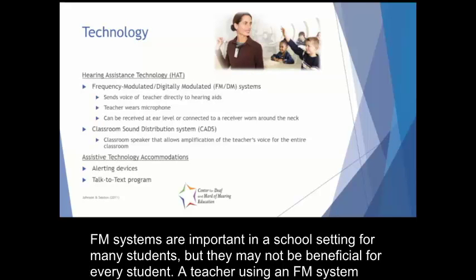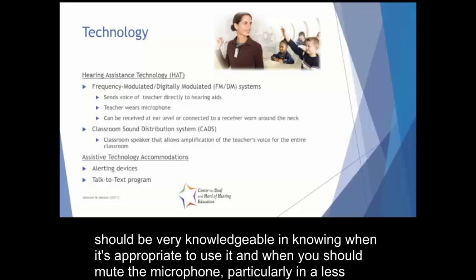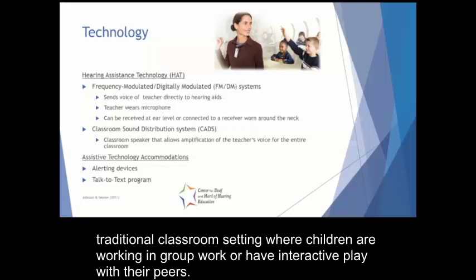FM systems are important in a school setting for many students, but they may not be beneficial for every student. A teacher using an FM system should be very knowledgeable in knowing when it's appropriate to use it and when you should mute the microphone, particularly in a less traditional classroom setting where children are working in group work or have interactive play with their peers.